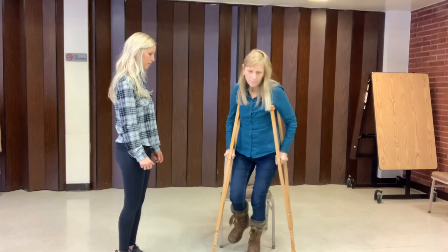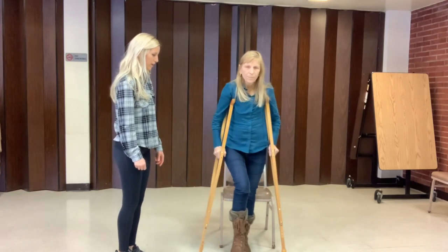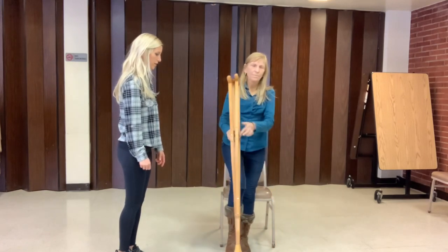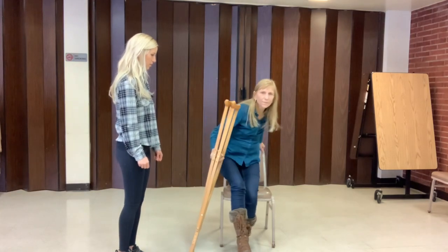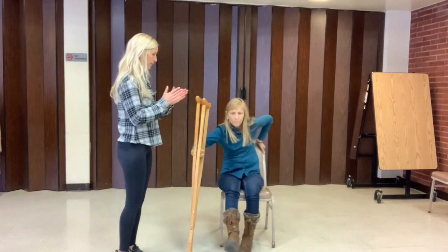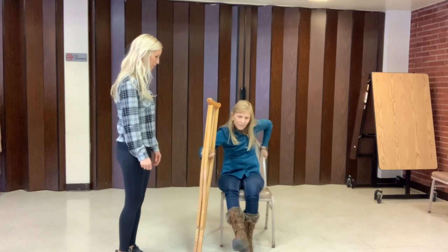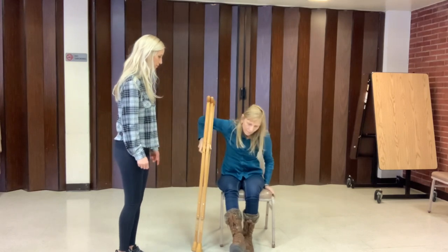Feel it with your good leg. It's better to bring your leg up in front of you, so it's kind of out of the way. Back up so you can feel the chair. Mm-hmm. Bring it over to the affected side or the injured side. Yes. Good job. Okay. Now you get back up. You can either push on the back or on the side of the seat there to push up. Oh, yeah, that's better. Okay.